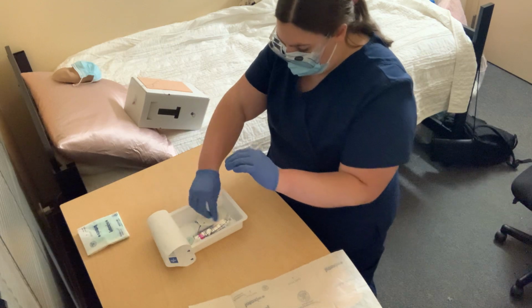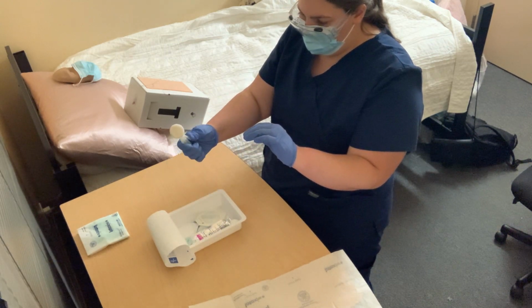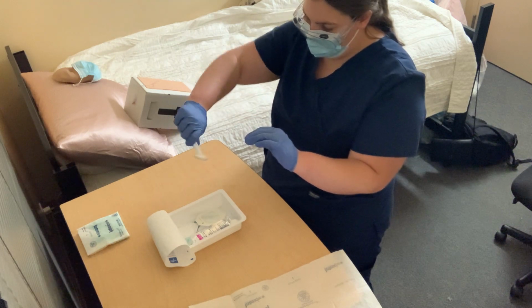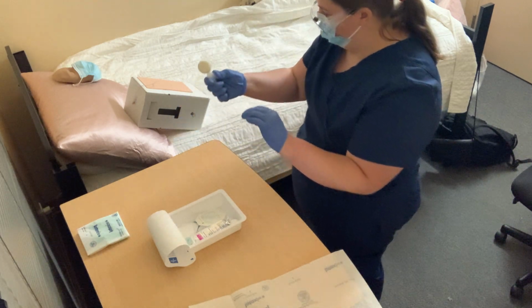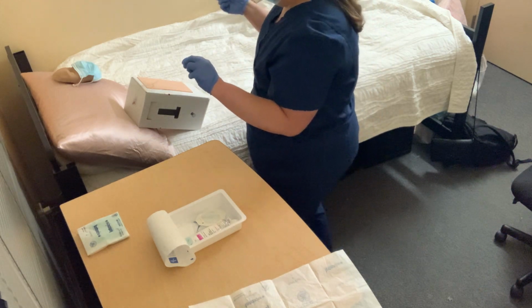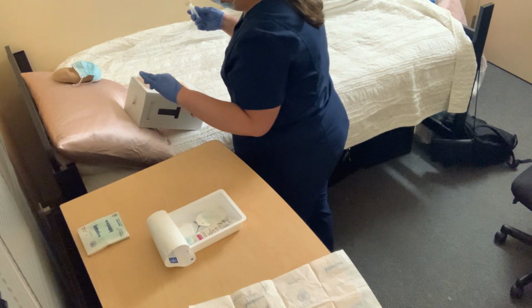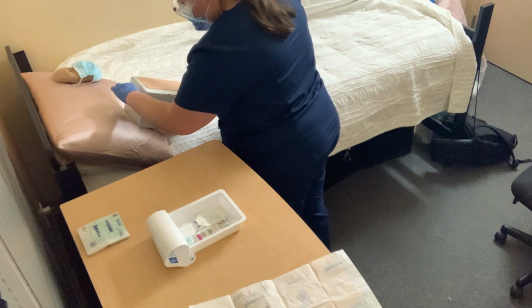Next, I'm going to grab the ChloraPrep. I'm going to crack it to get the chlorhexidine to the end of the tube. And now I'm going to start cleaning the site. Mr. Smith, I'm going to start cleaning around the site. Please let me know if you experience any discomfort throughout this process.